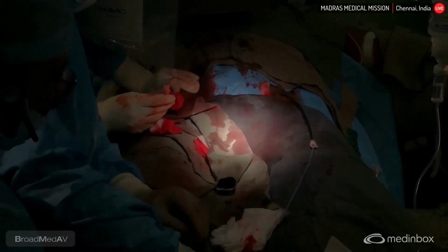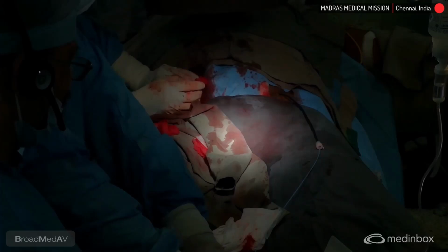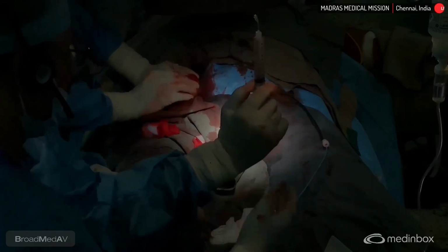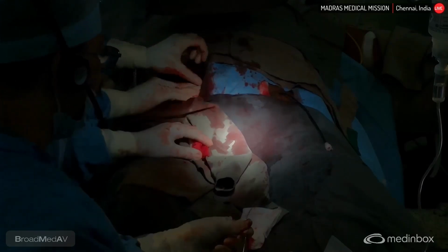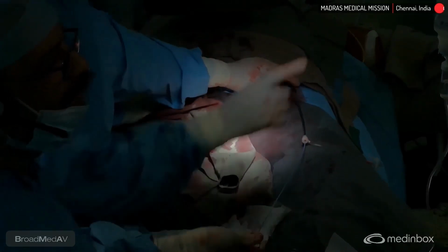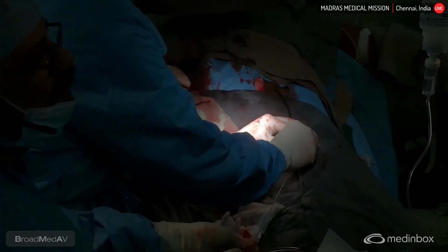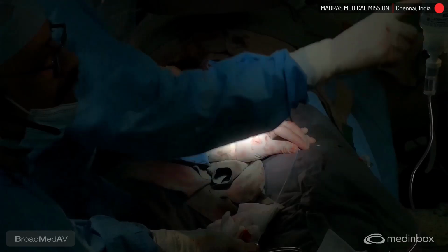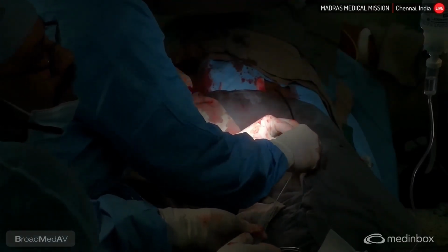I'll give a dye. Up. Push it up. Go up. Gently.